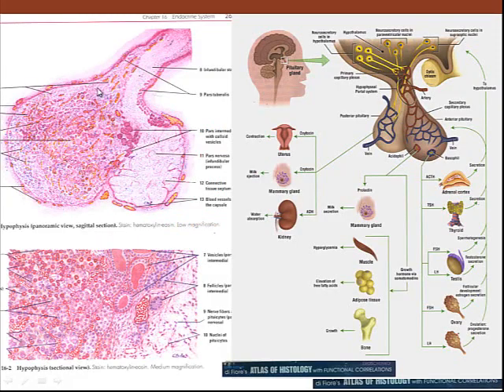So here we can see the pituitary, the pars tuberalis, the pars nervosa, pars distalis, and the pars intermedia. The pars intermedia has this colloid substance in through here, and we have a host of these epithelial cells or neurological cells in through here.